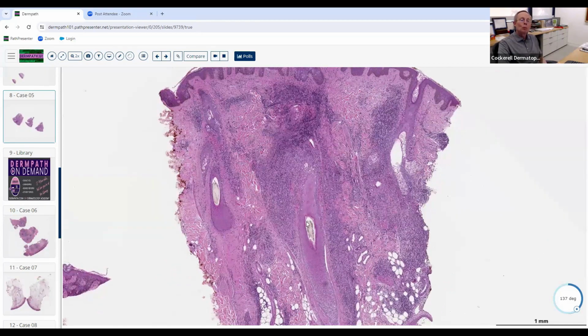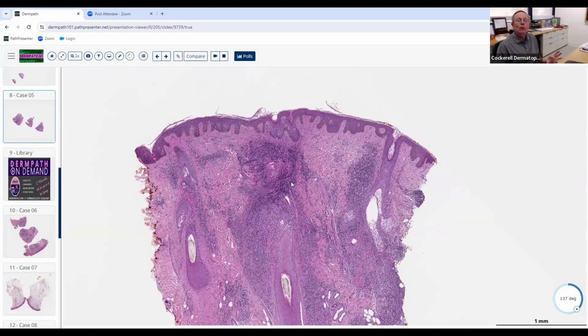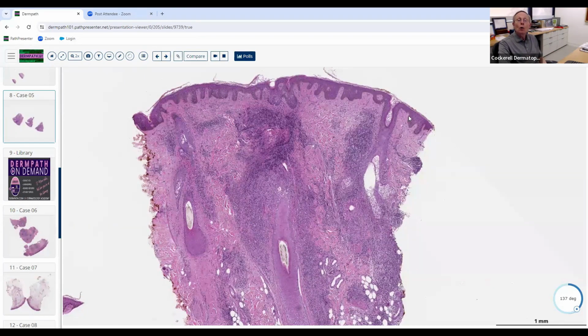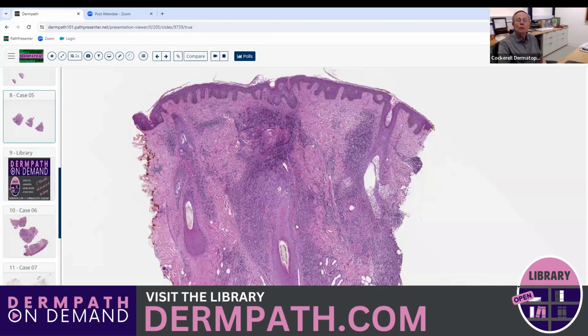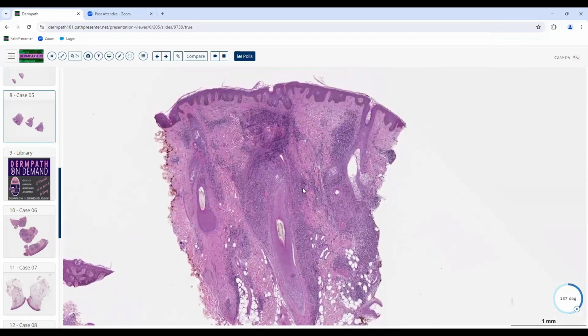Is there any form of lupus that you're aware of? And this is a more sophisticated, difficult question. Is there any variant of lupus that can give you this pattern where you don't get these changes up here, yet it's still lupus alopecia? I consider the possibility of lupus that has lymphocytic inflammation of the skin, but that will tend to affect the face more than the scalp.